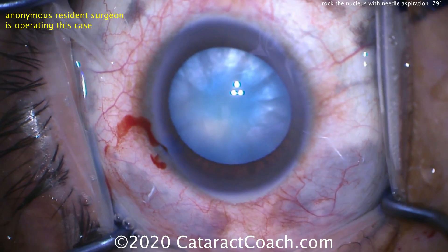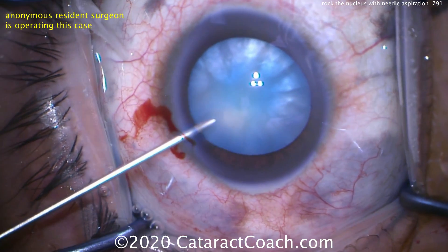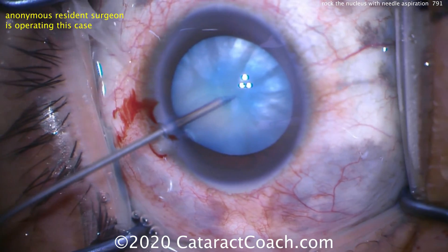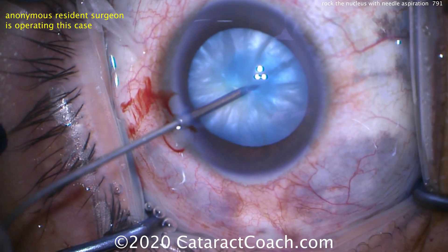There's the needle. We're going to poke into the center of the lens capsule, right in the center — stab in — and you'll see as soon as we poke in, milk will come out. That's the lens milk, the liquefied cortex. And then we aspirate. We can aspirate a lot of that liquid.